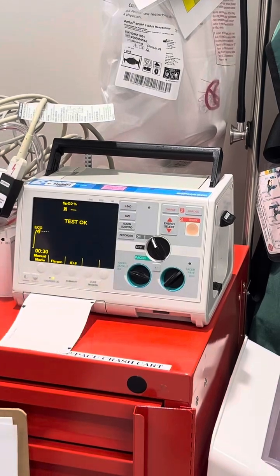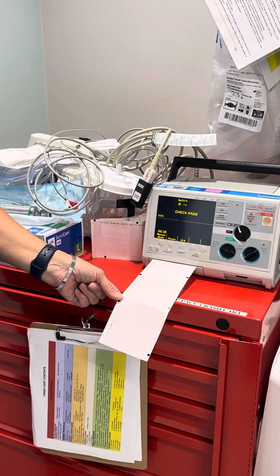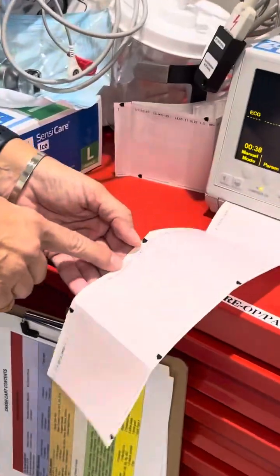Then you're going to shock it. Then it's going to print out your test strip. You want to make sure, because we just changed the date and time, that your test strip is correct.